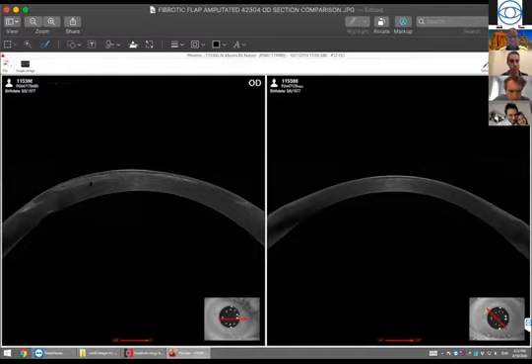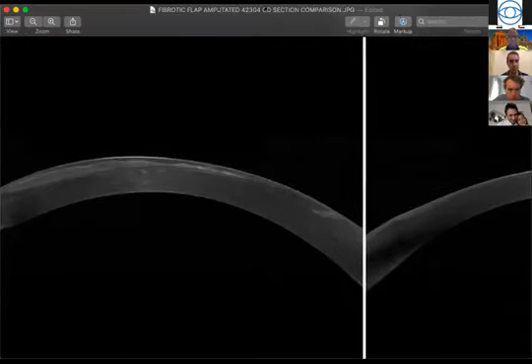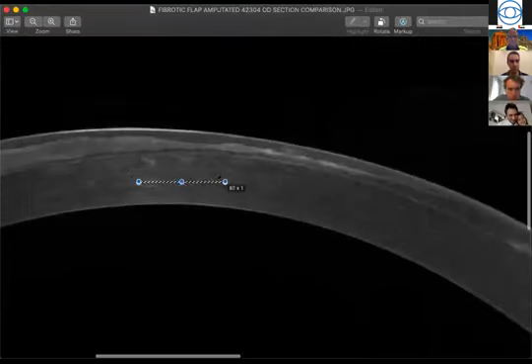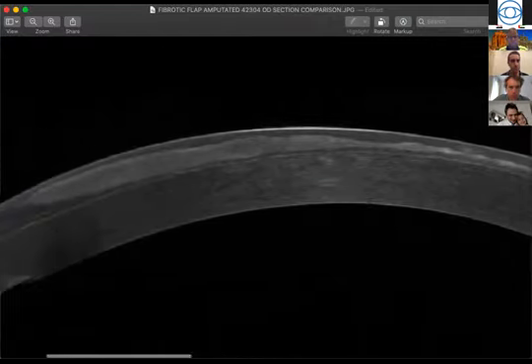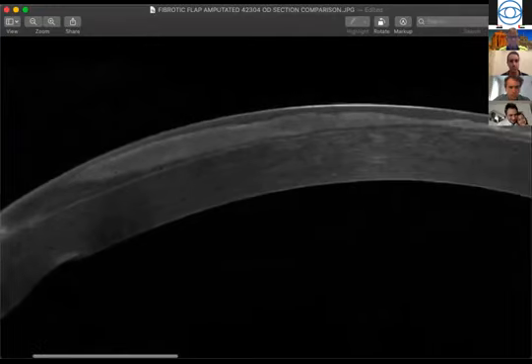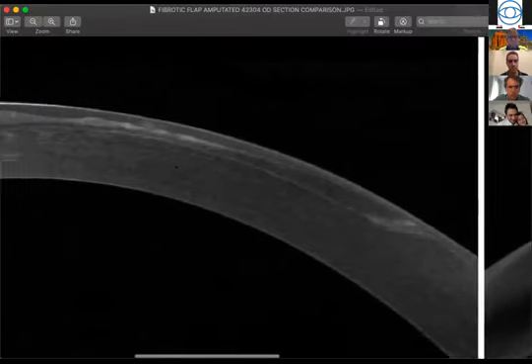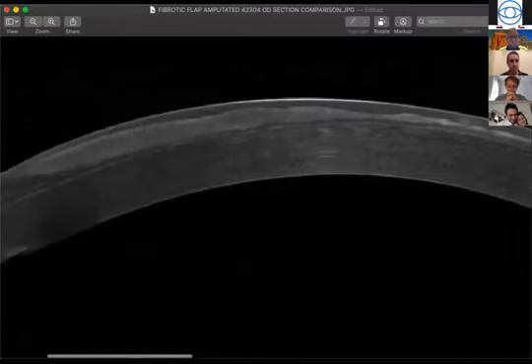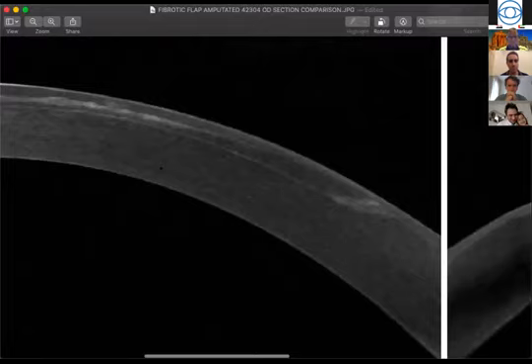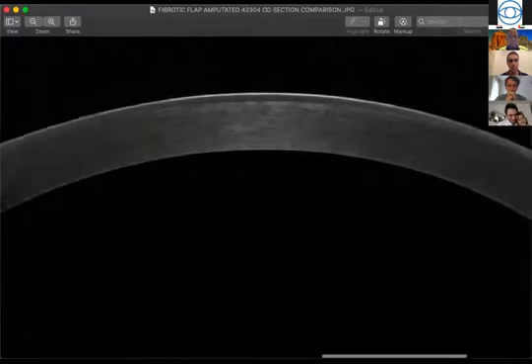The patient had a PRK over the flap, and as you can see here, the reason I decided to perform a flap amputation is because I saw clearly with the high definition section of the MS39 how smooth the residual bed was, and this is what we got after the removal.